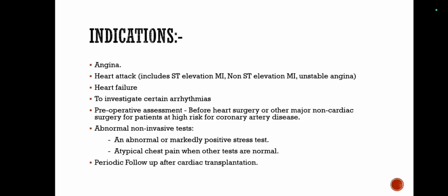Next is pre-operative assessment. This is for checking whether we can do the procedure without any upcoming problems, like maybe if the procedure is not related to cardiac surgery, the patient can have the risk of developing any kind of coronary artery disease if there is any cholesterol material that is stacked up in the coronary arteries. So they do coronary angiography for preoperative patients.